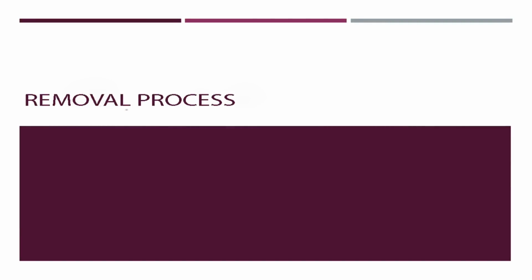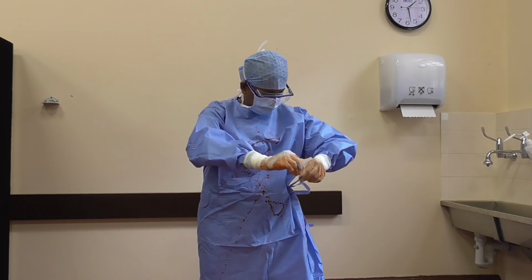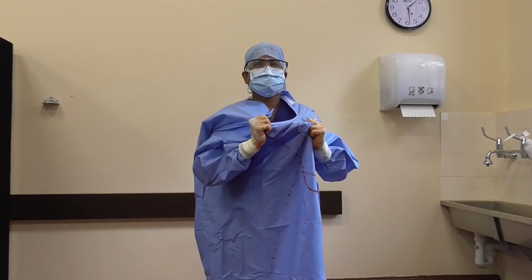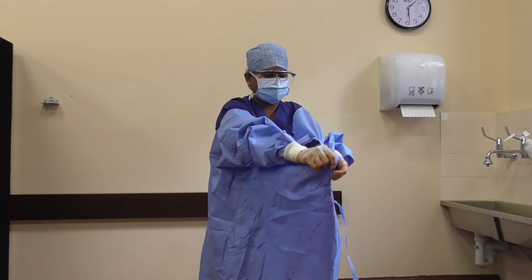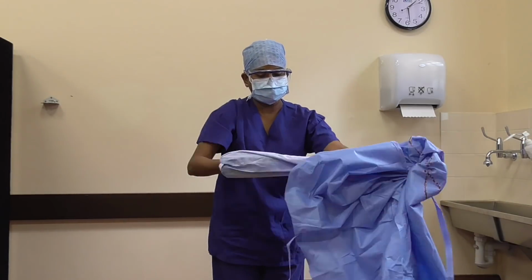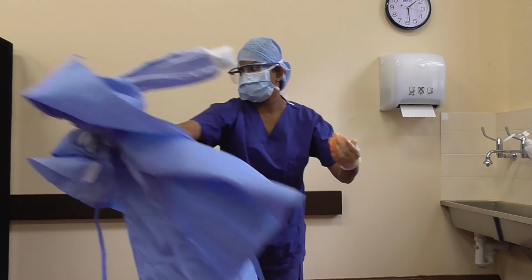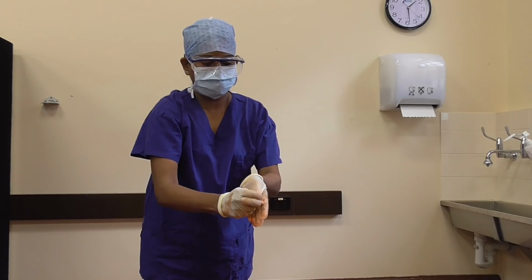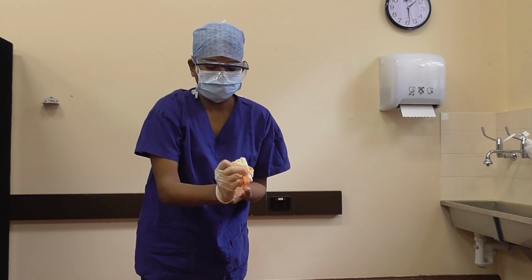Once the surgery is over, this is how you will remove your soiled attire. Loosen the ties and pull the gown forwards using force. Then fold the gown onto itself and discard it in the bin. Remove your gloves, ensuring you are going from dirty to dirty and clean to clean. Try not to flick the gloves.